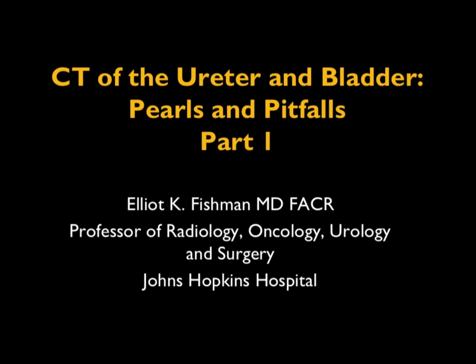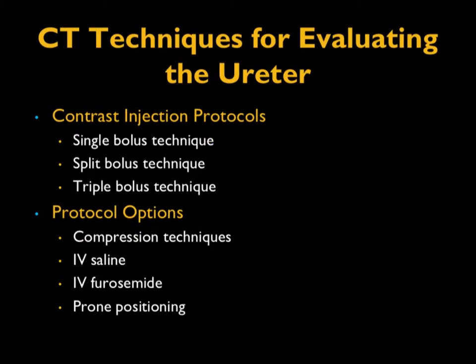Now, the first thing we'll mention, of course, is the technique. And technique is, again, critical in terms of looking at the ureter. There are a number of different protocols. People have used different bolus techniques, from triple bolus to single bolus to split bolus. People have used things from compression techniques to saline to IV Lasix to prone positioning. Now, the fact is, a lot of these protocols resulted in significant acquisitions and radiation dose, and as we became more careful with radiation, those protocols really were not good ideas.